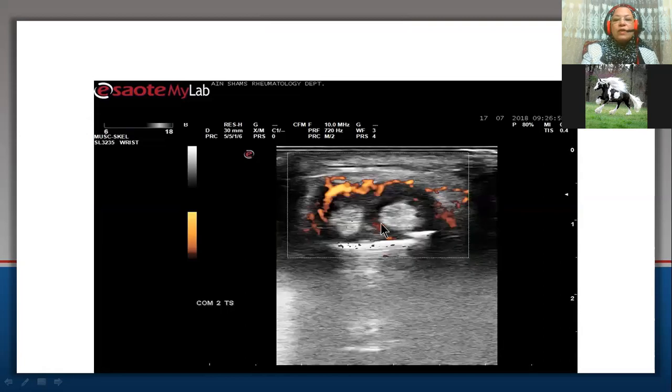On examination of the extensor compartments at her right wrist, there was tenosynovitis of the second extensor compartment containing extensor carpi radialis longus and brevis, with synovial thickening and positive Doppler signal. The patient was referred for steroid injection for this second compartment with tenosynovitis.